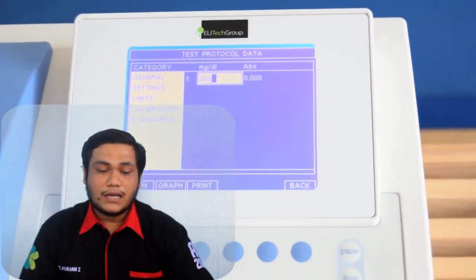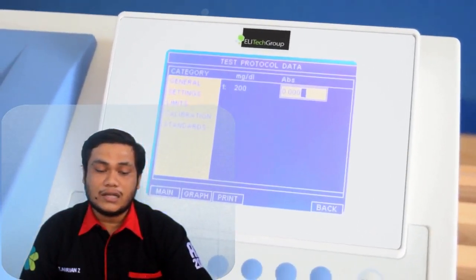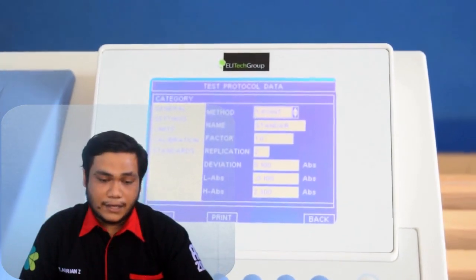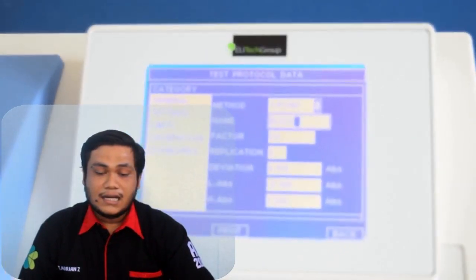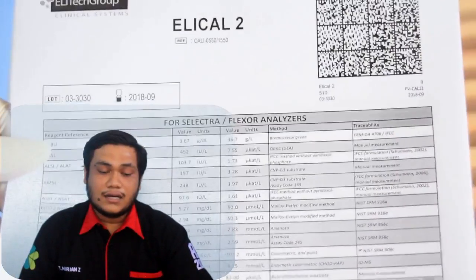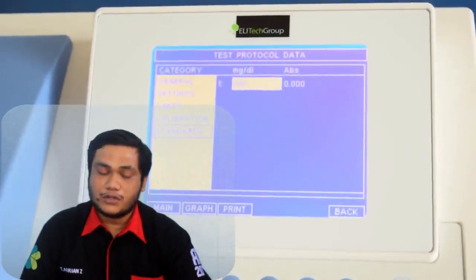If you want to replace the lamp, wait until the light is cool, because the light is so dangerous for your eyes or for anything else. Pull out the lamp from the socket to release it, and then use a dry, fat-free cloth and a brand new lamp. Don't touch the lamp with bare hands, because that will shorten the lamp's life. Then attach the lamp to the socket carefully until it fits into position.